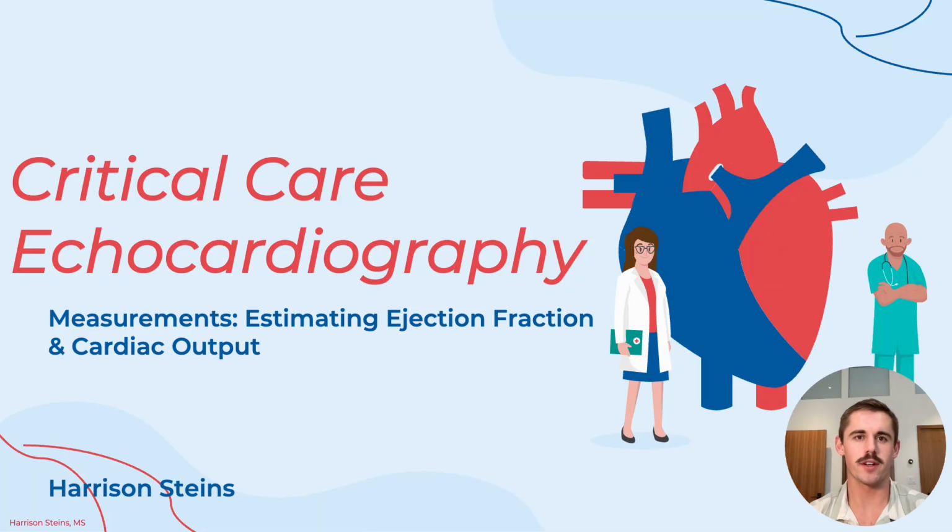Thank you for joining this installment of Critical Care Echocardiography, especially as it relates to the wilderness and austere settings. So, in the previous section, we did an intro into critical care echocardiography, kind of what the overall exam looks like, and we focused on the parasternal long axis view. This next section is going to be about measurements, so estimating the ejection fraction and cardiac output.